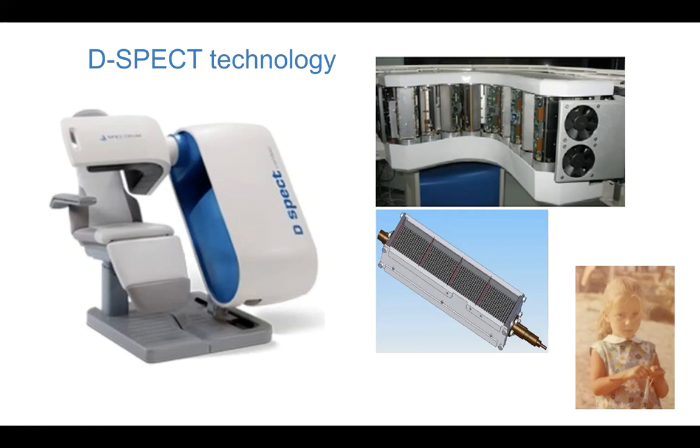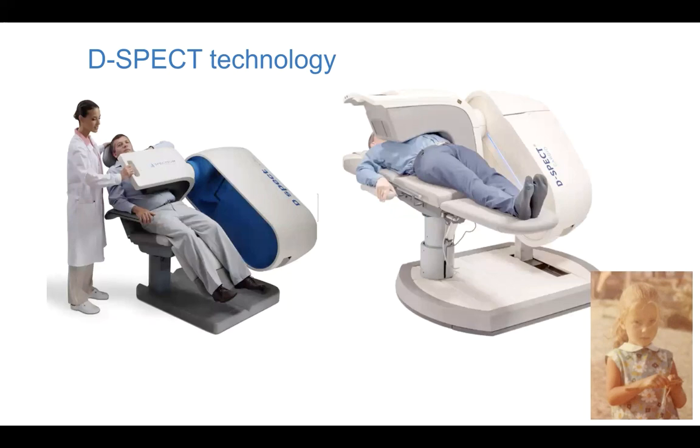So what about the image acquisition? The patient is placed on a dedicated seat associated to the camera in a semi-supine position. The left arm of the patient is placed on the upper edge of the camera arm containing the detectors. The camera arm containing the detectors should be placed as close to the chest as possible and to its left side, as the spatial resolution and image quality decrease with increasing distance between the heart and the detectors.